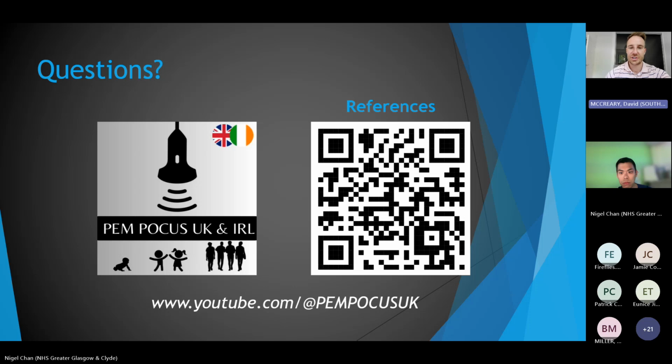So I can assure you, as Nigel will say, it is a real game changer. We've had some false positives, not many out of nearly 200, but in every case they've all had surgical pathology. We had a Meckel's that my colleague thought was an appendix, and an infarcted omentum with a lot of free fluid in the abdomen, about 10 recorded cases worldwide in the literature. So there have been some false positives, but so far no false negatives between us both. We just need to keep going and see how that looks.